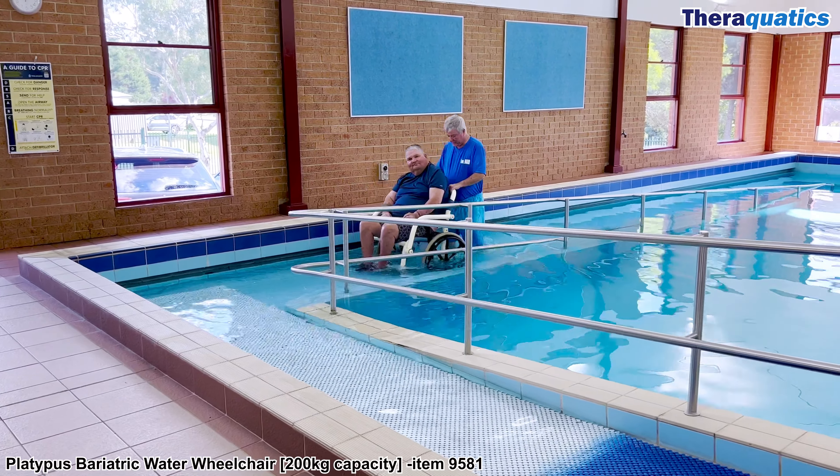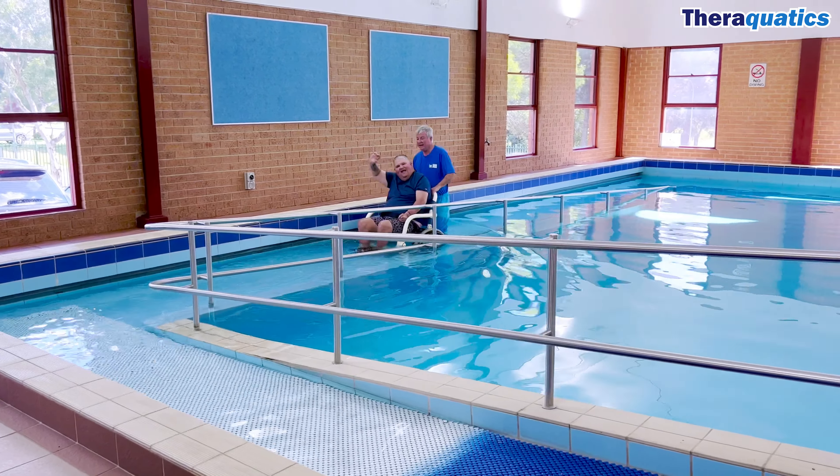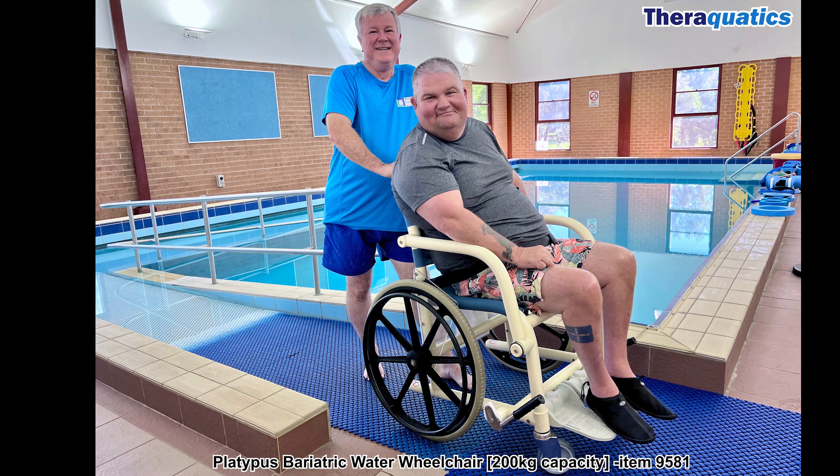Need a waterproof wheelchair? Try Fair Aquatics' Platypus Water Wheelchair. We have two sizes available: standard and bariatric.